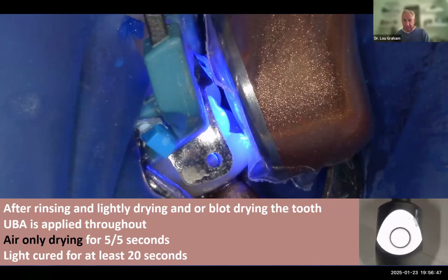And you'll see there's an air-only syringe tip. I don't use air water for this. Water comes out of an air syringe tip. So I don't want any water in my hybrid layer. So I want to be clear here. I'm going to rinse first and then just basically use a surgical suction and then blot dry. I'm going to then scrub my universal bonding agent for 20 seconds throughout. I'm going to air only dry lightly at a little bit of a distance, then a little bit heavier, and then I'm going to light cure for at least 20 seconds, moving my light to incorporate all the line angles.